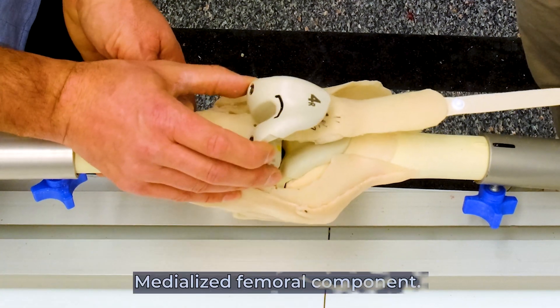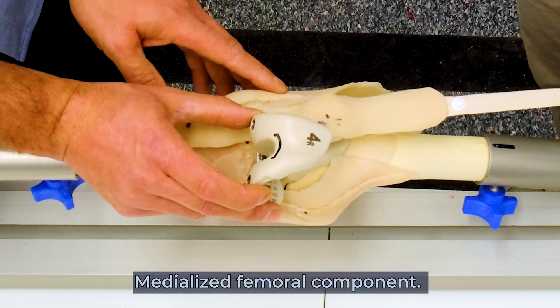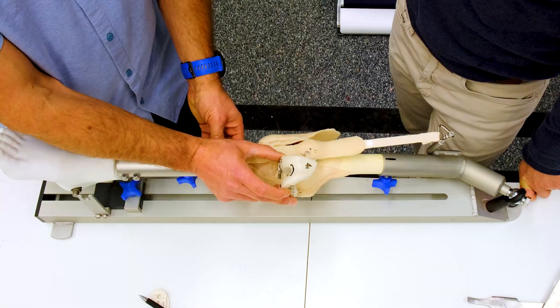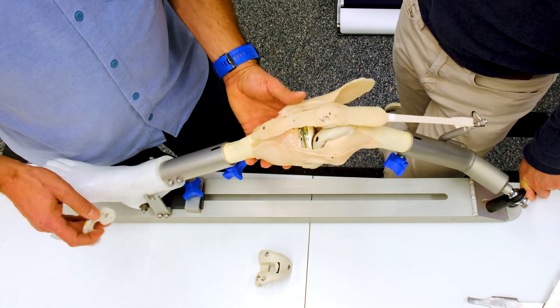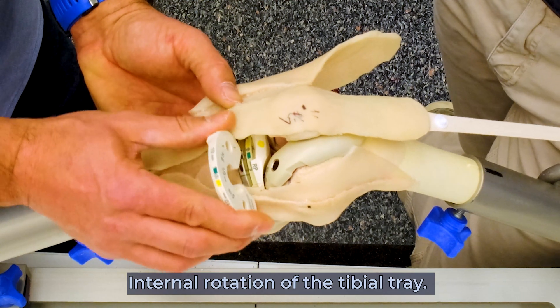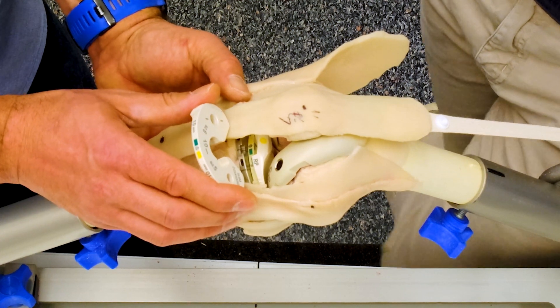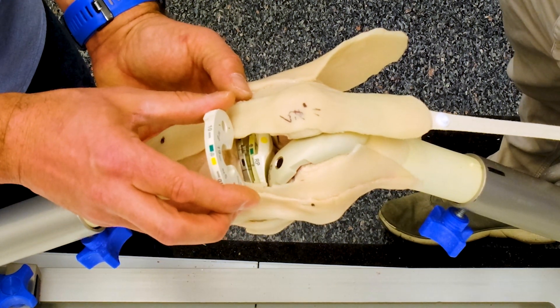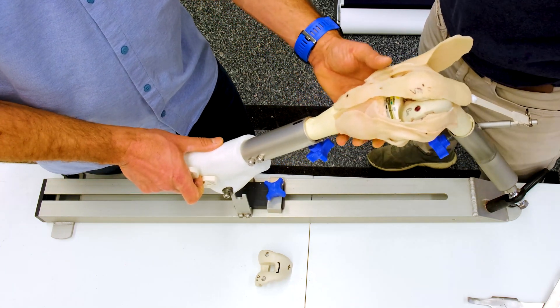Another possibility is that the femoral component is medialized. Pure math — the quadriceps angle is increased because the pivot point has changed, pushed medially when it should be lateral. So medialization and internal rotation are two culprits. A third thing that can change the angle of pull is where we put the tibial tray. If we place it in internal rotation, it will forcefully externally rotate through an arc of motion, since the tibia follows the femur. In a fixed-bearing construct, that forced external rotation again increases the Q angle.